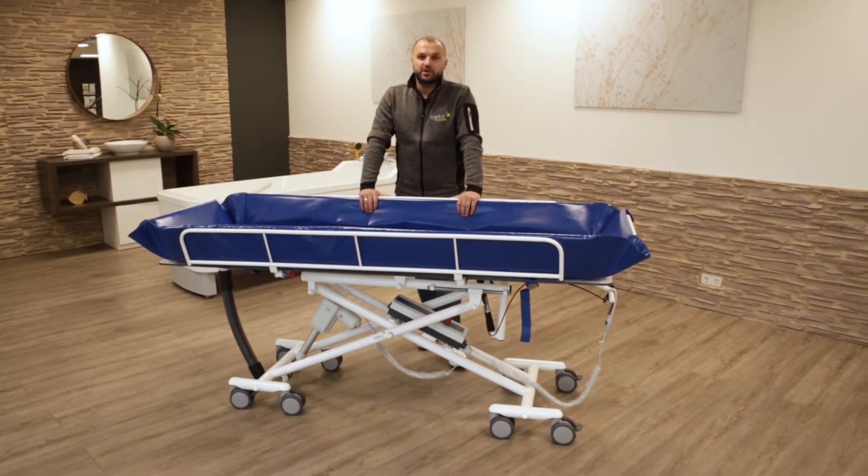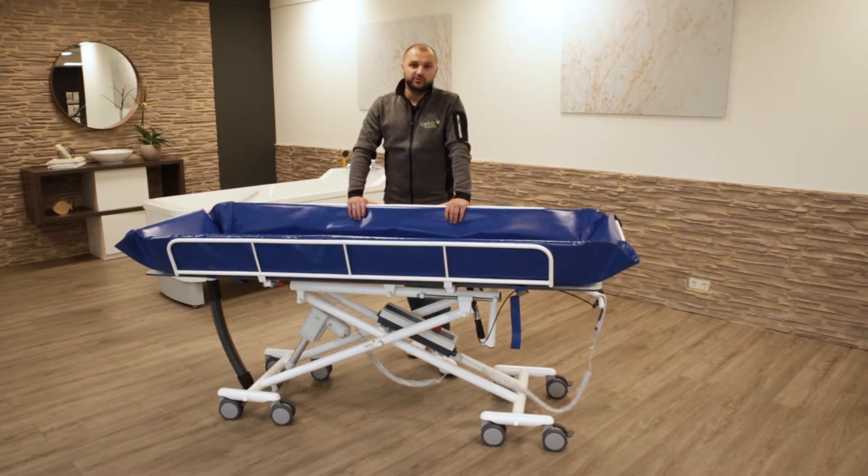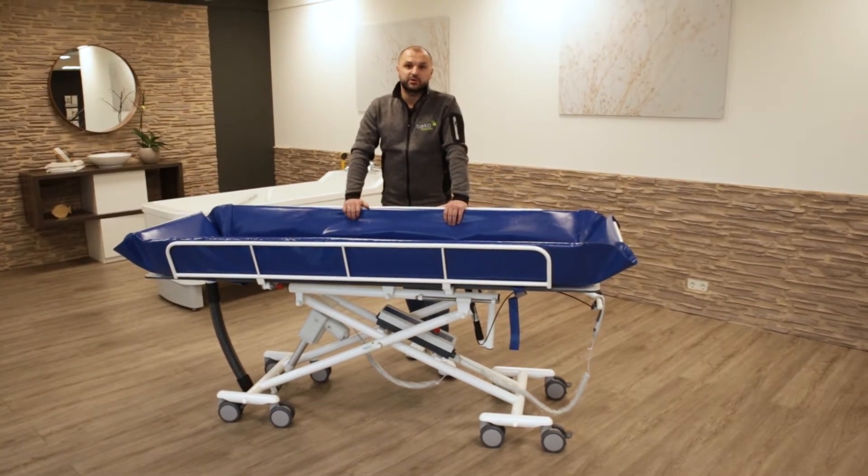Hello and welcome to a new service video. I'm Andreas, Service Manager of BEKA Hospitec, and today I will show you a few key points when you are servicing the shower trolley SINA.